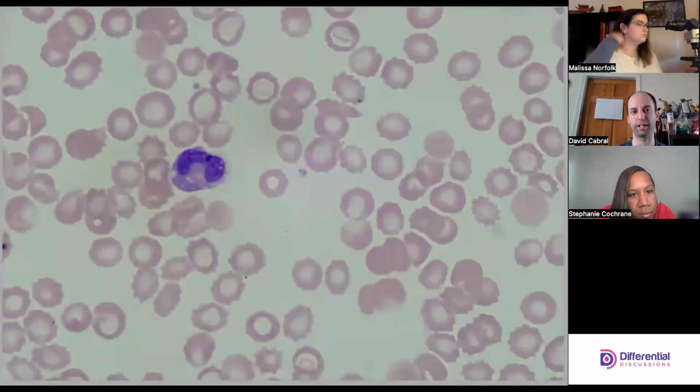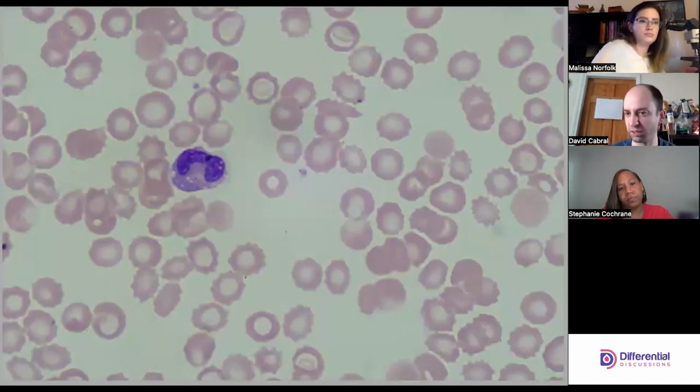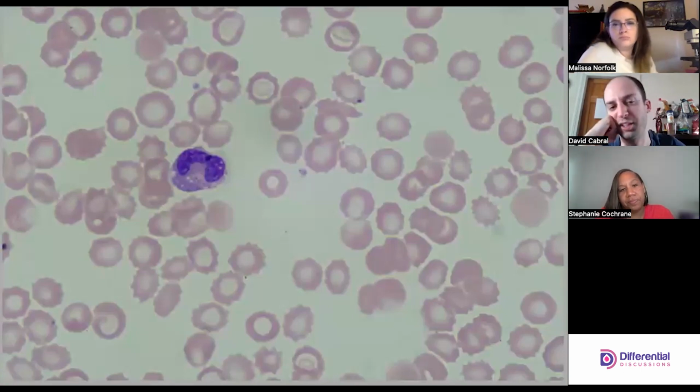Okay, so the echinocytes are now in my face. Those can also be artifact. So, small vacuoles inside the neutrophil. The way it's staining is a little dark and a little odd for what I might expect, but I'm going to be open-minded and agnostic at the moment. But okay, so maybe we can start really cruising now.